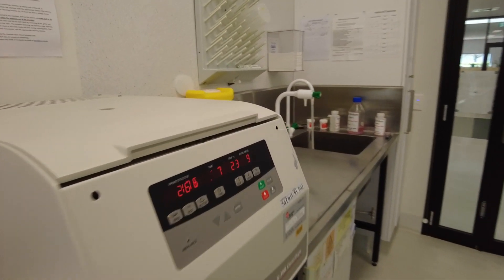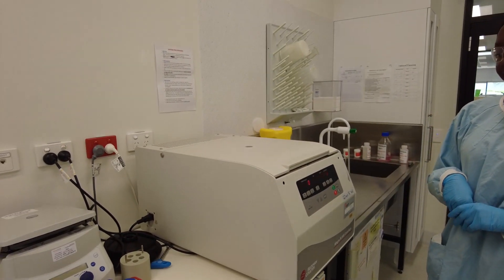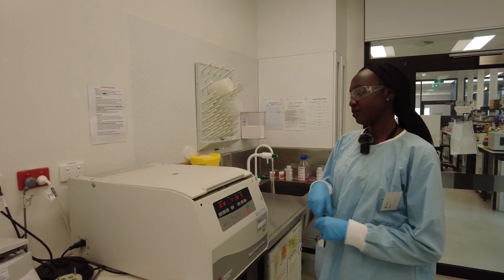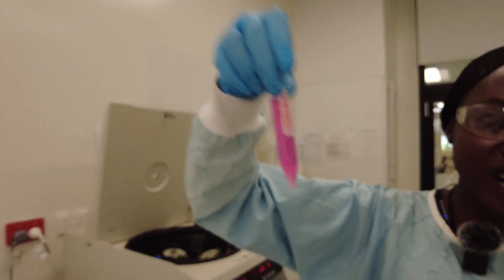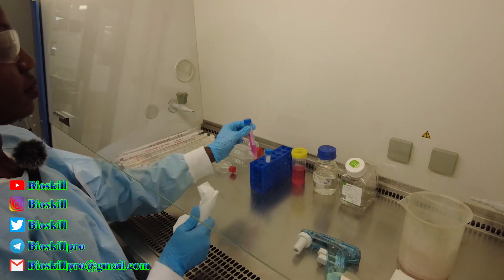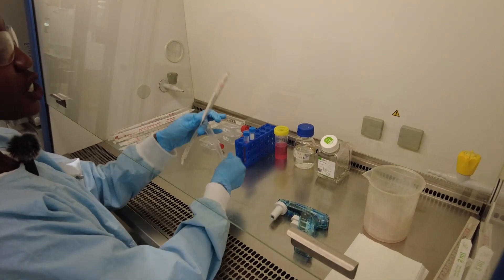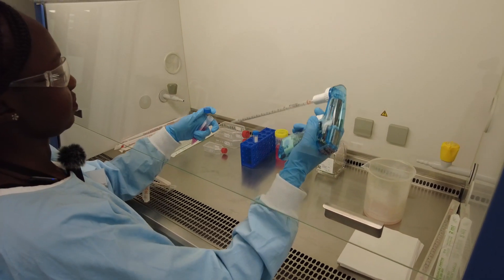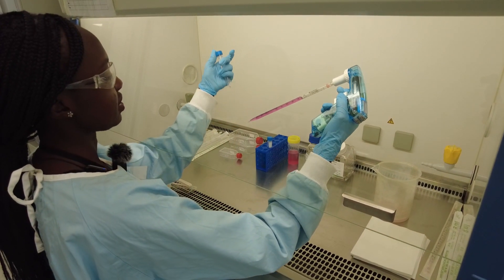The centrifuge is about to beep to let us know the seven minutes is over. We take our centrifuge tube out — there we go. Our cells are at the bottom; it's only a passage one so there's very little cells, so we're going to grow them. Now we're going to discard the supernatant, or the media, and we're going to put fresh media in there. We take about 95% of the media out — the cells are at the bottom as a pellet.